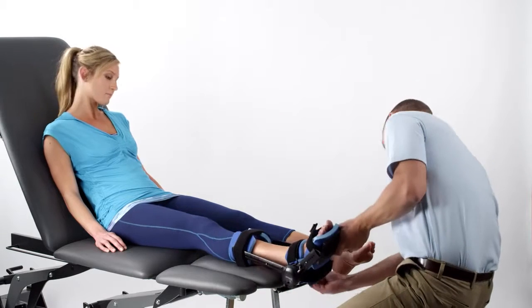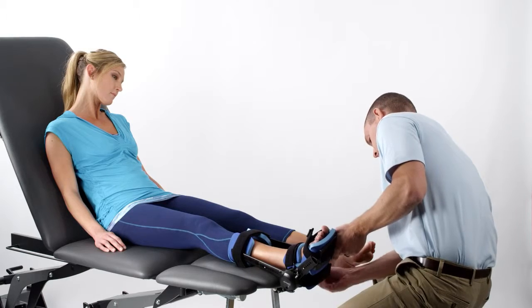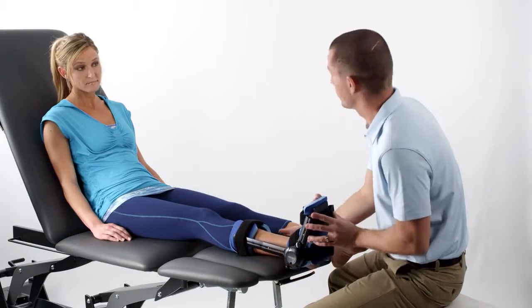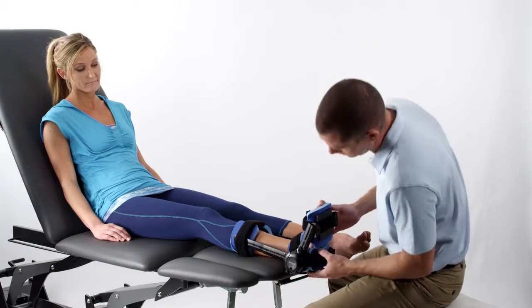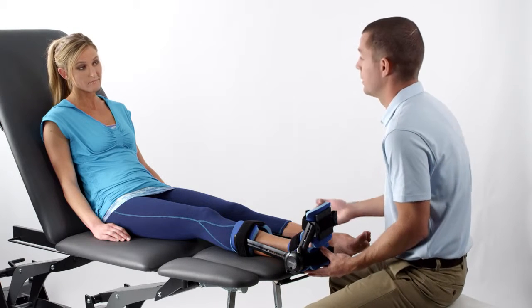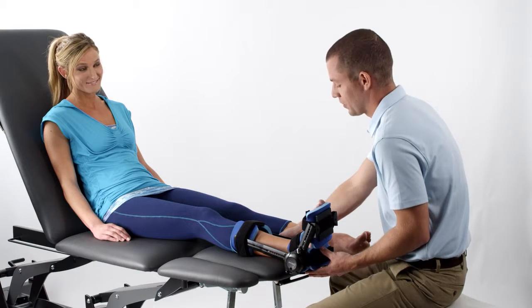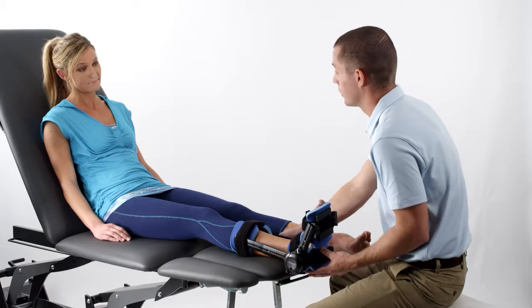At the initial fitting, set the tension level at a very mild pressure that is comfortable for the patient, and instruct the patient to wear the orthosis for 1 to 2 hours. Monitor the patient to determine their tolerance to the device. If the patient cannot tolerate the initial tension setting and wear time, a physician or therapist should reevaluate the patient.